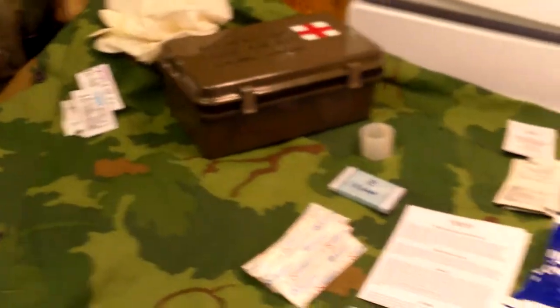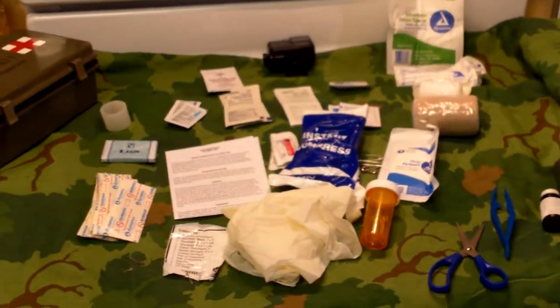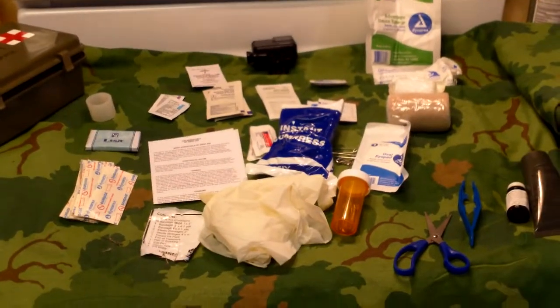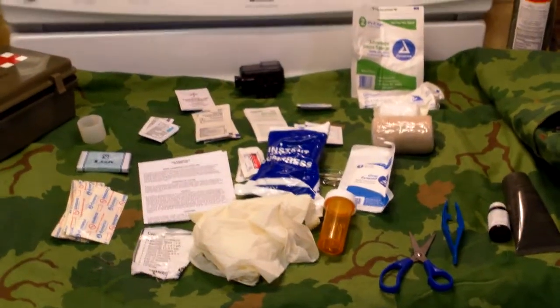Anyway, that is my review of the Elite First Aid general purpose first aid kit. Overall, even with those items needing replacement, it's still a very good kit. If you can get your hands on one, I'd definitely recommend it if you don't already have a general first aid kit. Hope you guys enjoyed it, and as always, have a nice day.